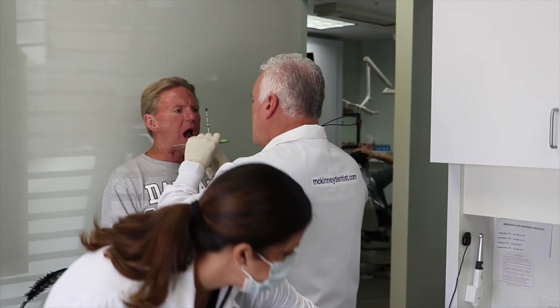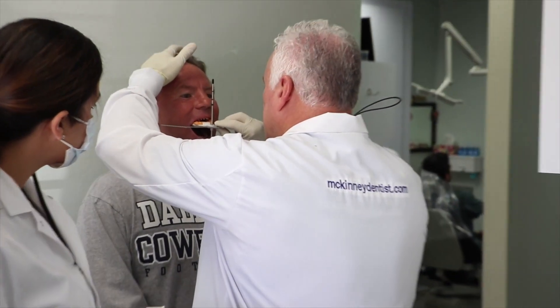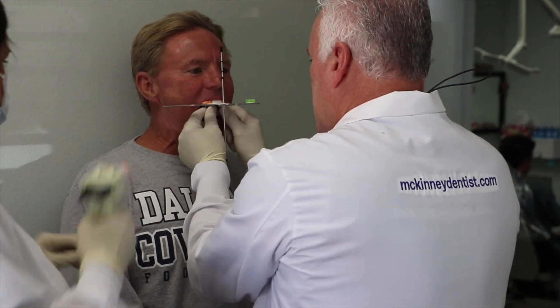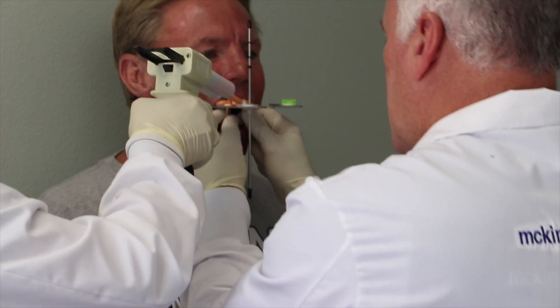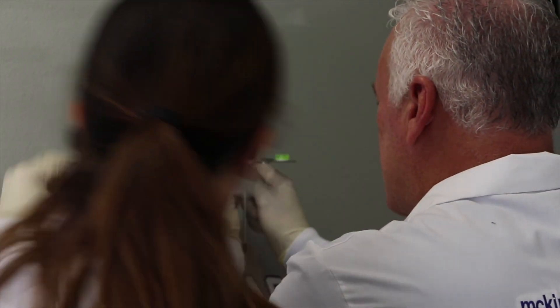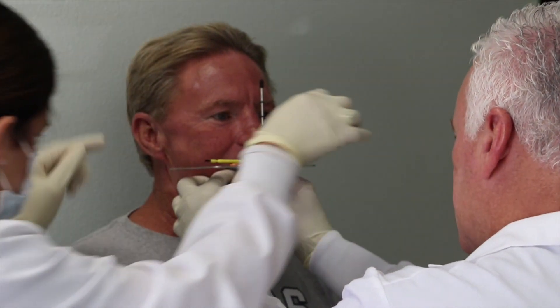Brad, open for me. I'm going to set this right here. I want you to tilt your head down a little bit. I'm going to hold this in position. Tilt your head down just a little bit — I want to make sure that this is going straight up and down your nose, which it is. And then I'm looking at the plane and making sure that it's parallel with his eyes.